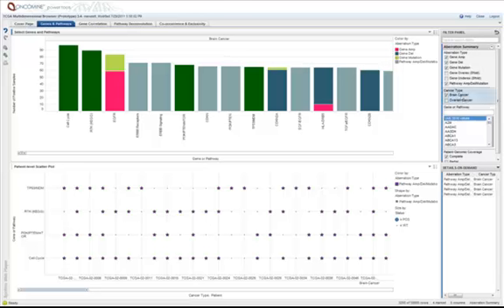What we're summarizing are the genes and pathways that most frequently have genetic alterations in the glioblastoma TCGA study. We've turned off gene overexpression and gene underexpression, focusing specifically on genetic alterations, namely gene mutations, amplifications, and deletions, and pathway alterations. This is an analysis based on all of the raw TCGA genomic data, as well as a predefined set of pathways that we've curated here at Compendia and have used routinely in our biomarker studies.